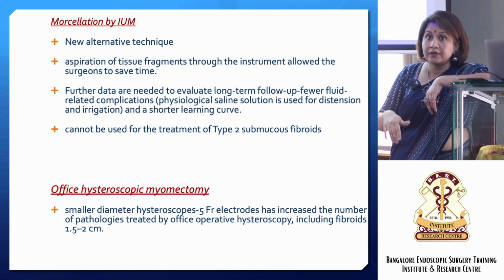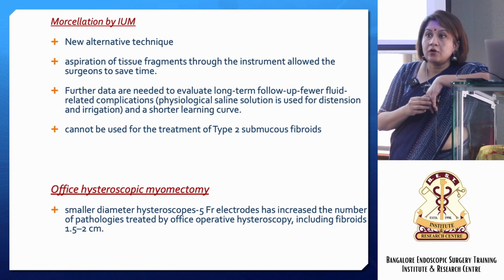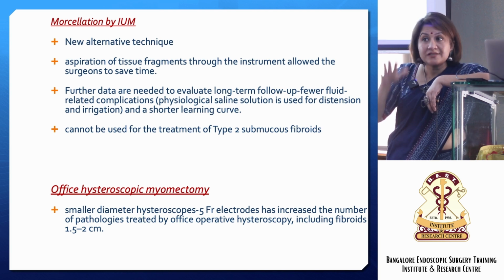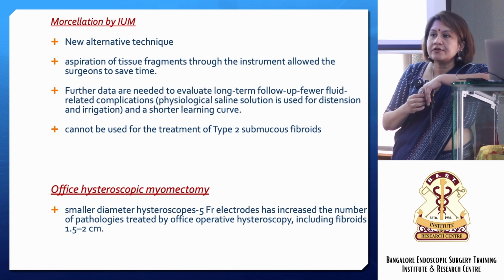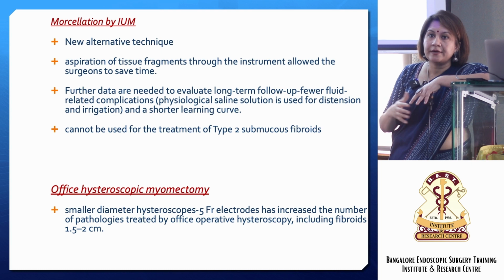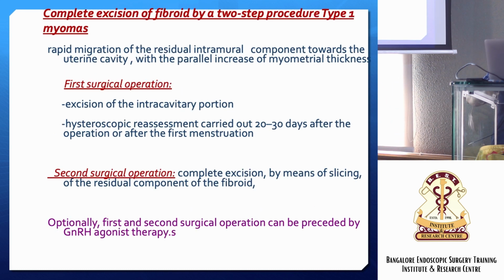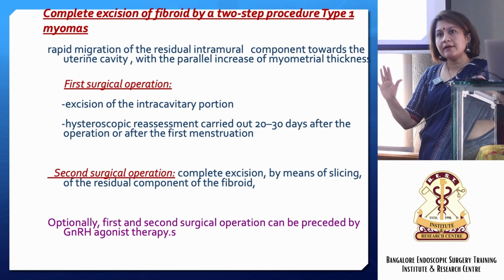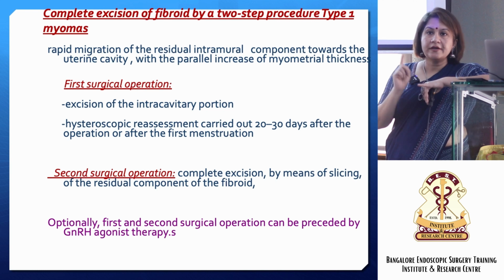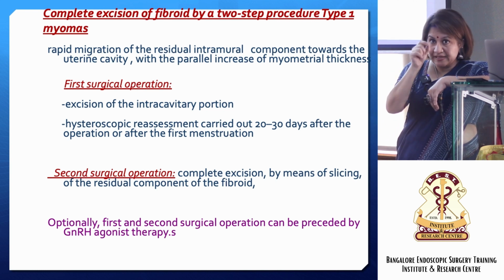In India the company has now come back again and is trying to push it. In the conferences, I've seen him trying to push it, and he wants to keep it and demonstrate it, but the costing has to come down. Not everybody can afford to buy a 25 lakh setup only for hysteroscopy, right? So that's where we are as far as the morcellator is concerned. It's only mechanical, no cautery. The advantage is saline and no cautery.